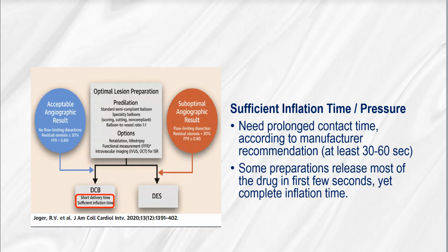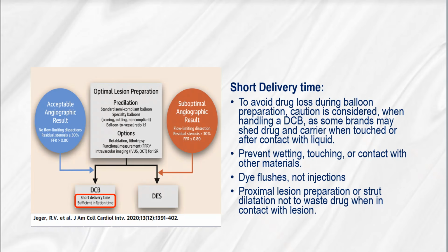Some preparations release most of the drug in the first few seconds, yet complete inflation time. A very short delivery time is essential. To avoid drug loss during balloon preparation, caution is considered when handling a drug-coated balloon, as some brands may shed drug and carrier when touched or after contact with liquids. Prevent wetting, touching, or contact with other materials. Dye flushes, not injections. Proximal lesion preparation or strut dilatation, not to waste drug when in contact with the lesion.